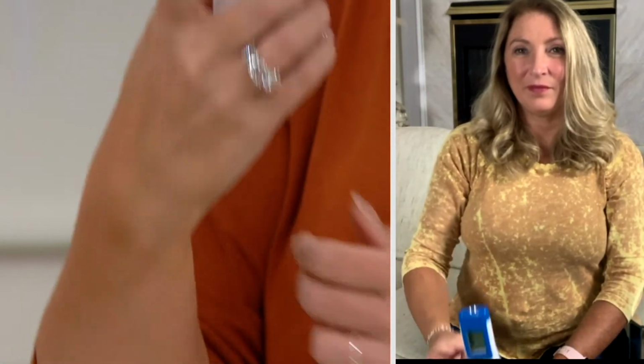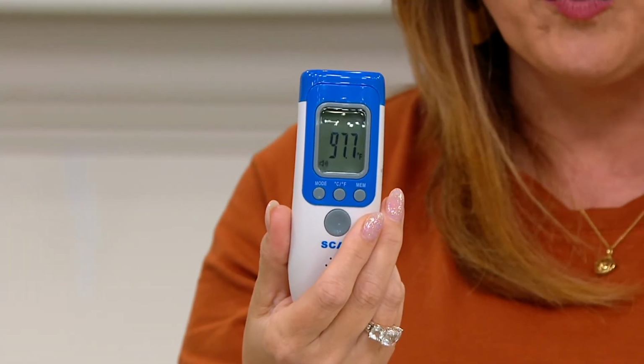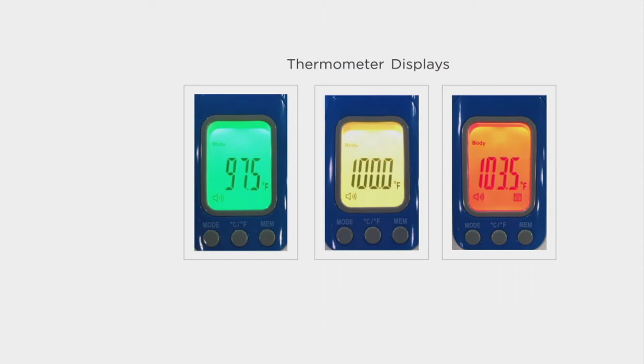So hang on, body, going for my forehead, hit scan, get about 2 inches away. You hear it beep? Now it says 97.7. So I know we have a chart that we're gonna pop up and talk about. Okay, that says 97.7. Now what, Janine?